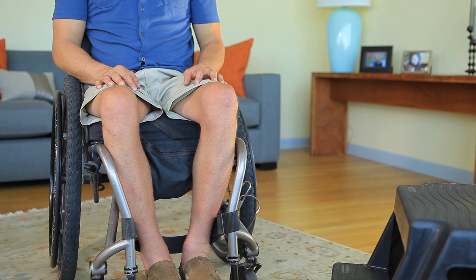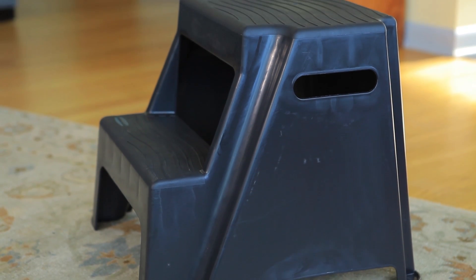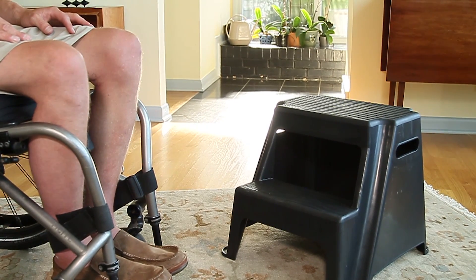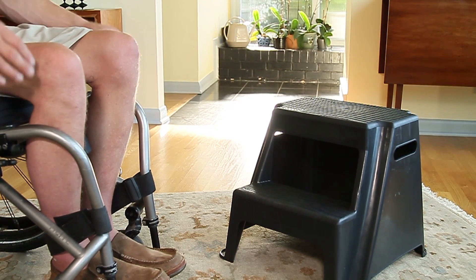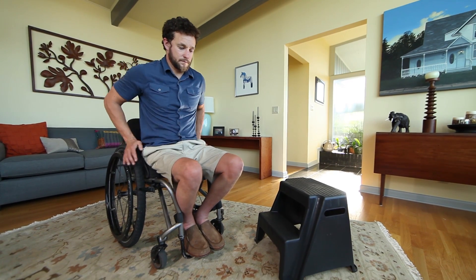If the distance between your wheelchair and the floor is too great, use an object such as a step stool to simplify this transfer. You can transfer in one of two ways: shifting from your wheelchair to stool to the floor, or you can move directly between the wheelchair and floor while using the stool as a taller handhold with more leverage.